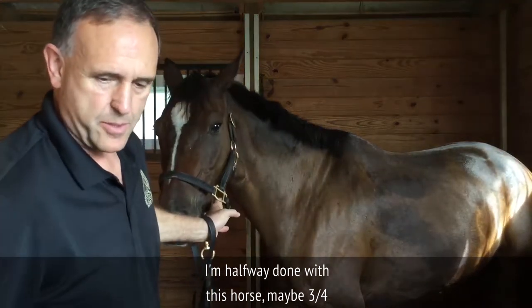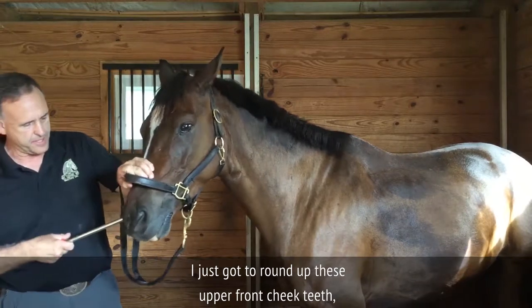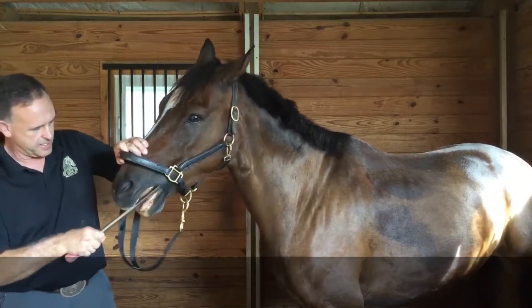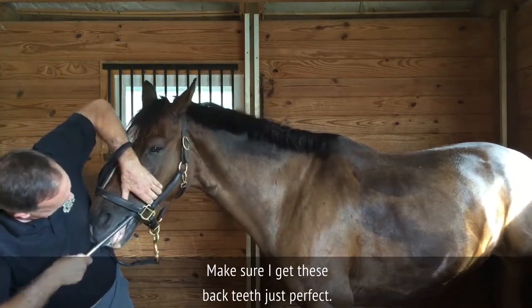I'm halfway done with this horse, maybe three-quarters of the way done. I've just got to round up these upper front cheek teeth and scoot them aside. Make sure I get these back teeth just perfect.